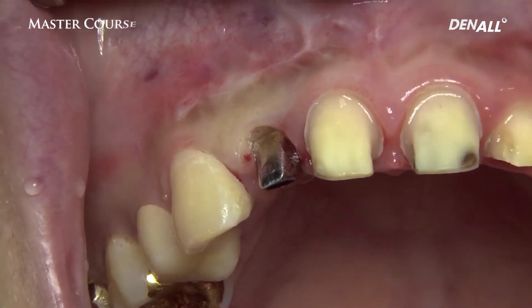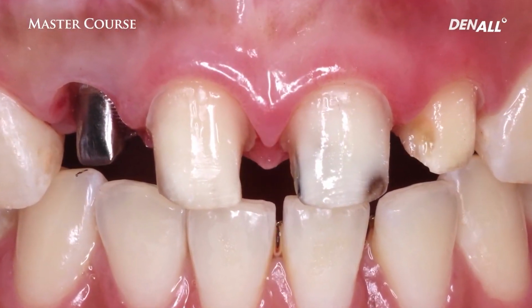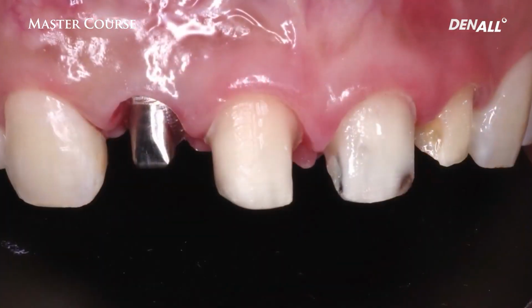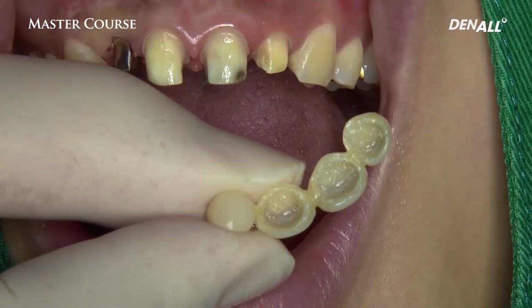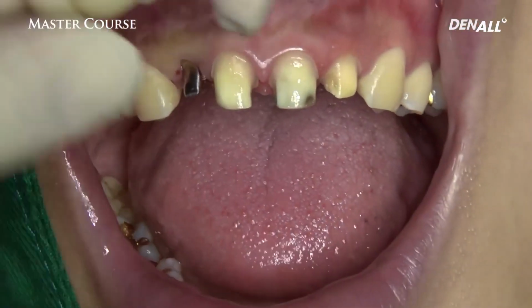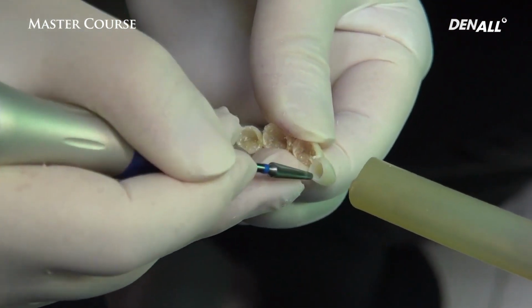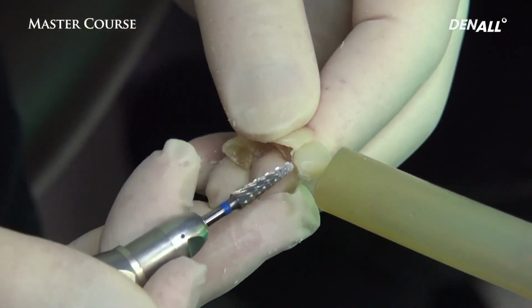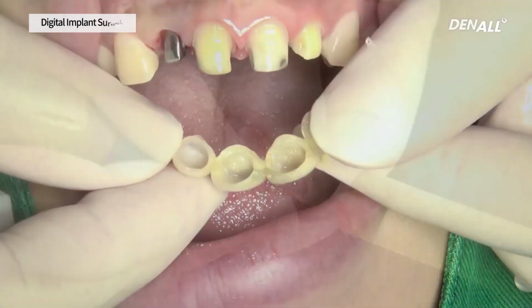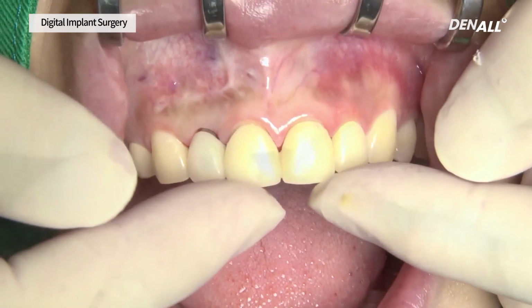An initial stability of 20 Newton or more is achieved for the implant. It looks as if the tooth is prepared, and the abutment appearance looks really beautiful. After that, the cantilever splint crown used by the patient before is mounted after the inside is reduced.